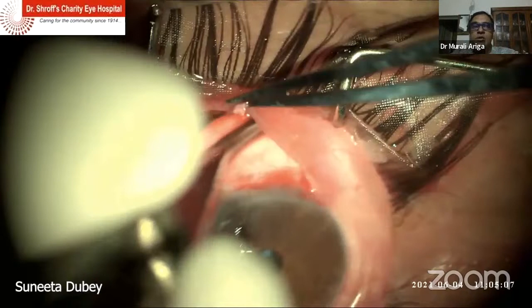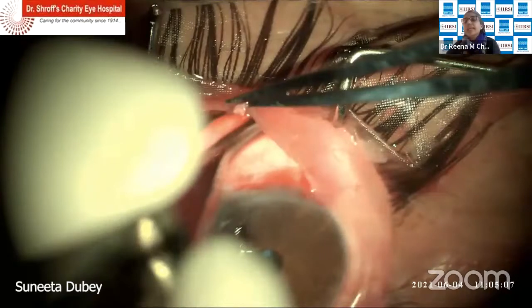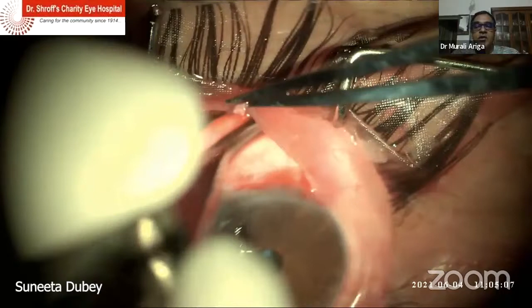Just one more point about Ologen is that when you're placing it, it must be a little beyond the apex of the flap. The second thing is the flap should not be sutured very tightly. Exactly. If you suture the flap very tightly, the aqueous will not percolate through the Ologen, and you do need aqueous perfusion through the Ologen for it to work. So you do need to keep it a little behind and make sure the flap is not tightly sutured, and the Ologen should not rest on top of the flap. If you place it on the flap and suture it up and cover it with conjunctiva, the bleb will not elevate at all.